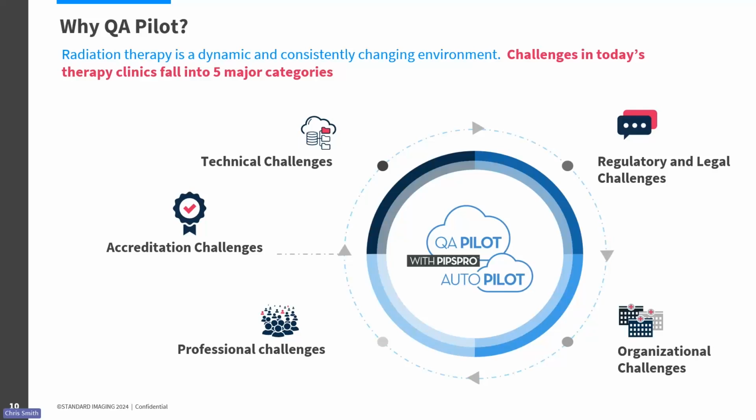That would be really kind of disingenuous to, one, the complexity of workflows that you have within your own organization, but also it kind of hides the true power of QA Pilot, which is our ability to customize and tailor these workflows to you, your standard process, your standardization, with many different stakeholders within your clinic, remote clinics or larger health systems as a whole, right? So everyone from physicists to therapists to administrators all the way down can have a part to play here when we need to sign things off or we need to do some sort of audit or get ACR accreditation, for example. We have this nice repository and trail that we can keep tabs on all of these things.